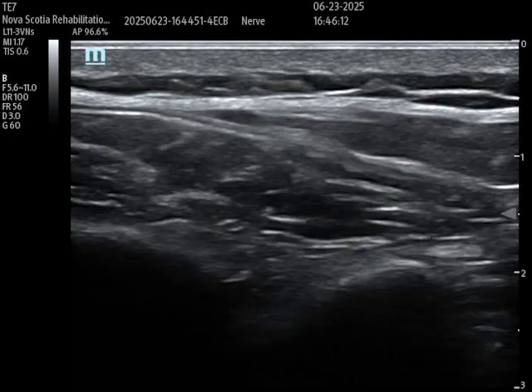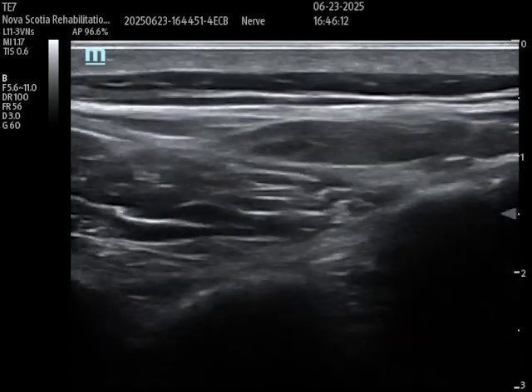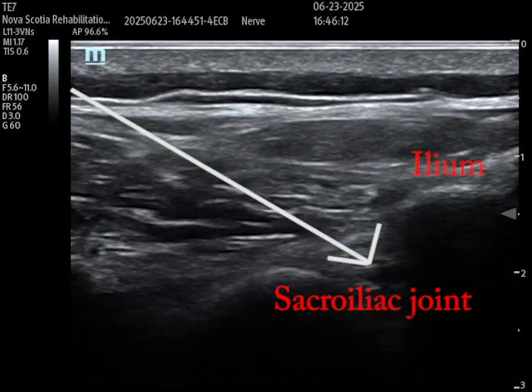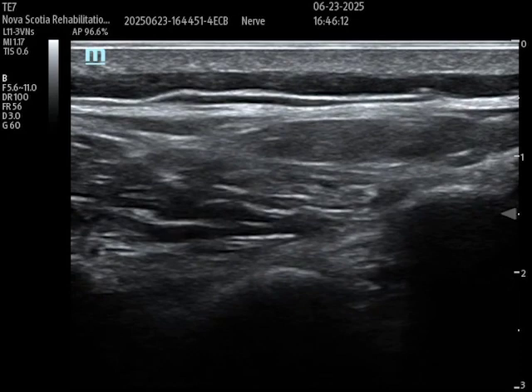Moving the probe slightly laterally — and there we go. I also had to rotate the lateral aspect of the probe more cranially. There I've identified my sacroiliac joint. I could bring my needle in-plane with the arrow shown. On the left of the screen is the sacrum; on the right is the ilium. You can see how easy it is to mistake the sacral foramen for the SI joint, but the SI joint lies lateral to the foramen. That's how you would approach the injection.